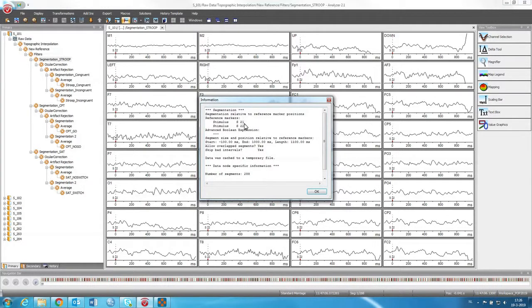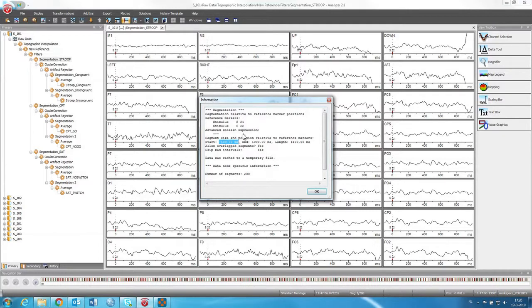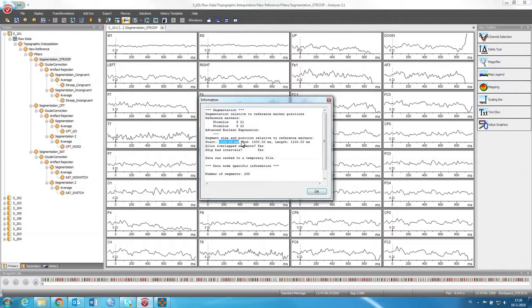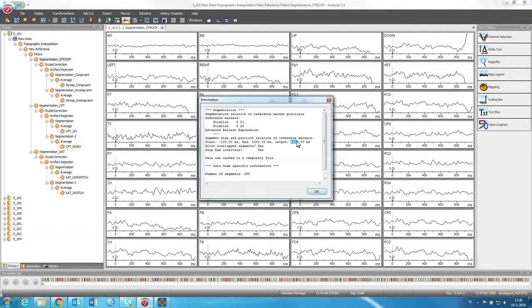So it's stimulus S21 and S22. And then what was done is 100 milliseconds before these stimuli were presented, we want to cut the data until 1000 milliseconds, or one second after the data. So in total we have 1100 milliseconds of data for every event.